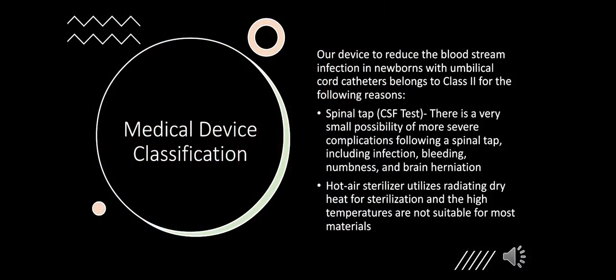Our device belongs to class 2 for the following reason. Spinal tap test: there's a very small possibility of severe complications following the spinal tap, including infection, bleeding, numbness. And the hot air sterilizer utilizes radiating dry heat for sterilization at high temperatures.